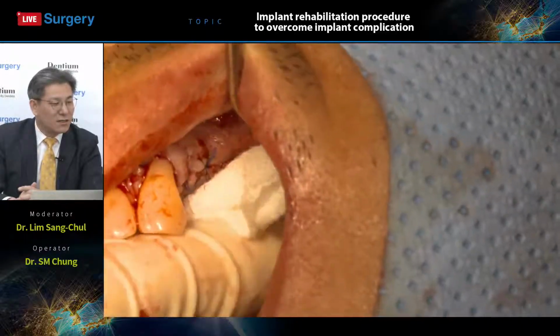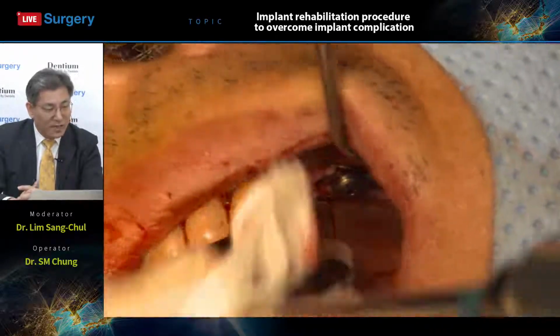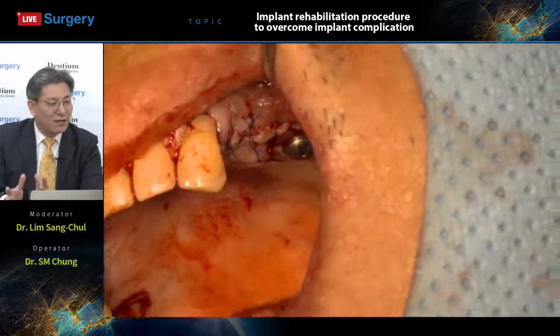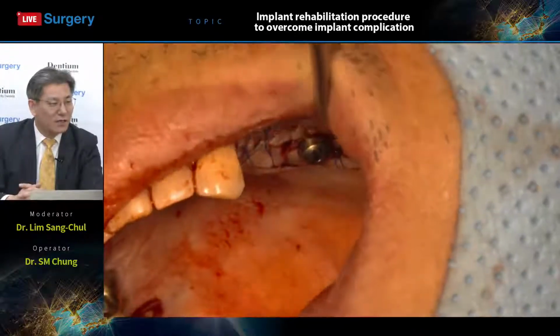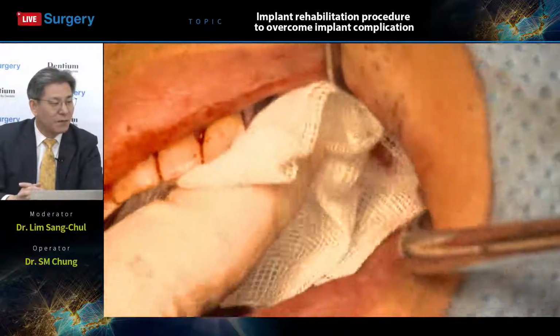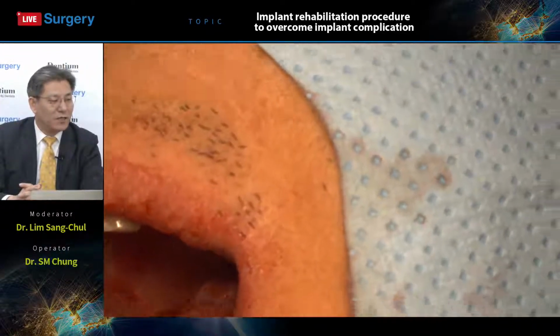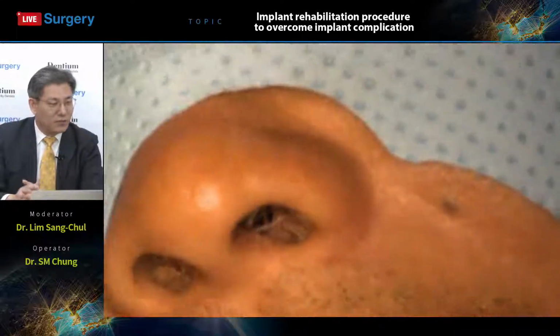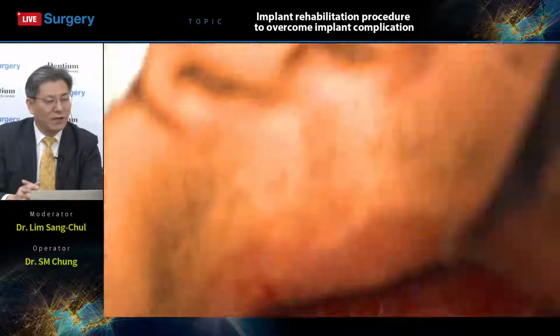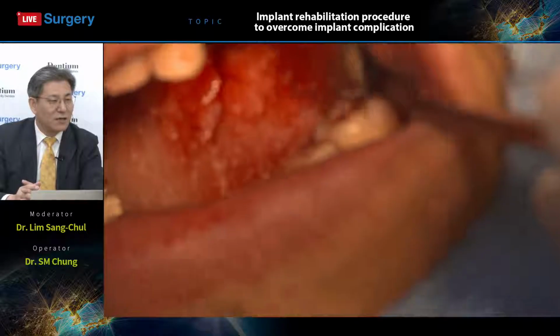So, yeah, the ordinary peri-implantitis, the late failure areas make a big defect. Looks like the same as this patient case. Right? So it is very difficult to manage, the proper prep management and the proper GBR procedure. Anyway, successfully all these upper left area procedures have been done.